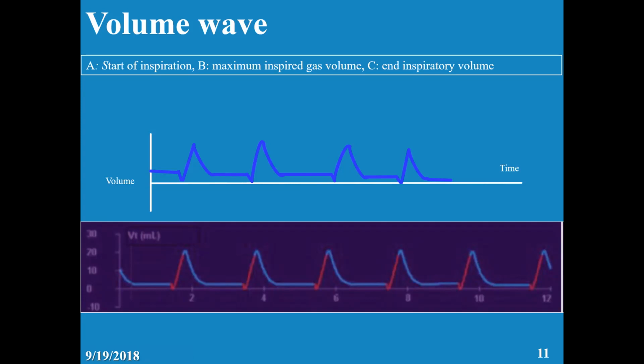Any other opinion? It's very important that you start discussing, because by discussing you will learn. You don't need to shy or hide. It's pressure control, not volume control, because there is no plateau phase.